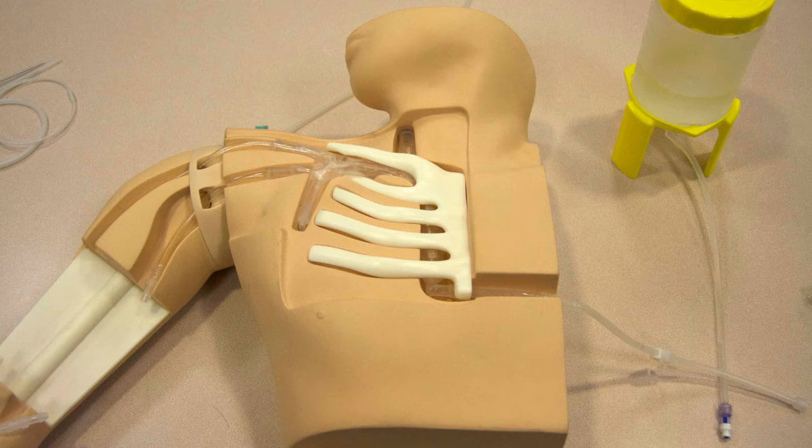Today we're going to talk about the Kyoto Kagaku PICC Phantom. You can see the phantom here — we have the torso with the vessels leading up to the join into the subclavian and into the SVC. You can see the cutaway so that you can see all the vessels throughout the procedure. You also see the reservoir that will be attached to allow fluid or tinted fluid to simulate blood to course through all the channels in order to have your vessels filled with blood for drawback.